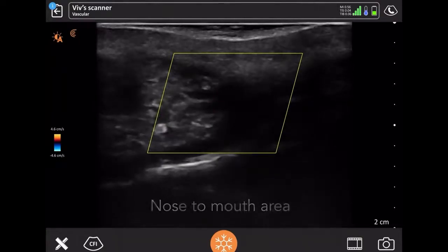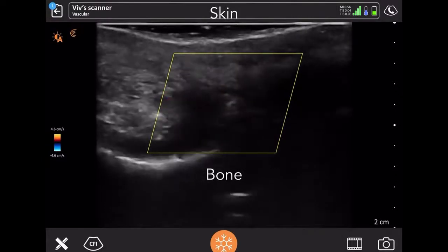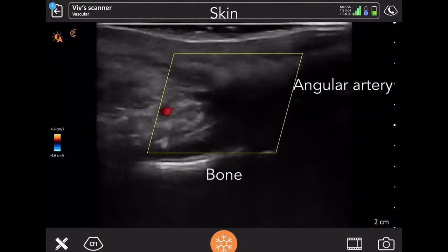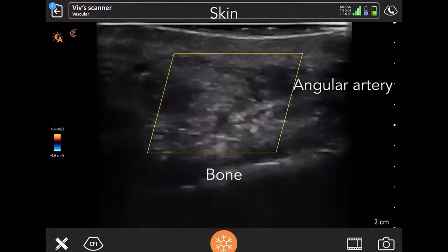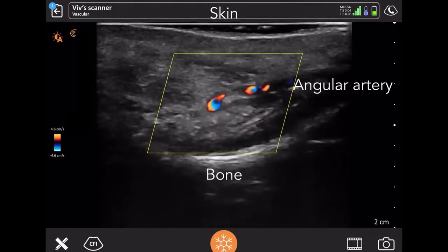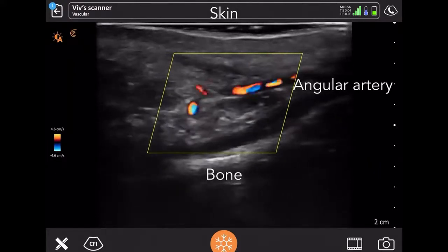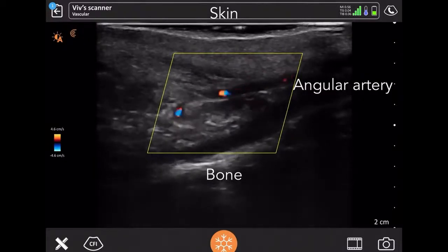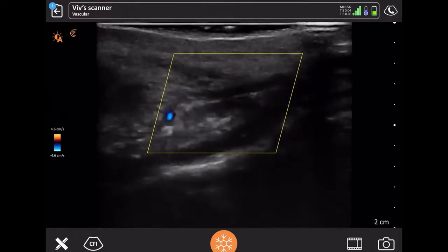Here I'm actually looking at the area just along my nose to mouth area. So the bone's at the base of the picture and the skin's right at the top. And in the area in the middle is a flashing area, which is blood flow. When it looks orangey, it's blood flowing towards you. When it's blue coloured, it's flowing away from you. So it doesn't give an indication of temperature or speed. It gives an indication of the direction of the blood flow.